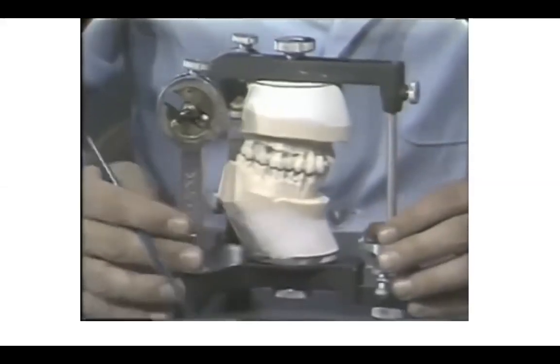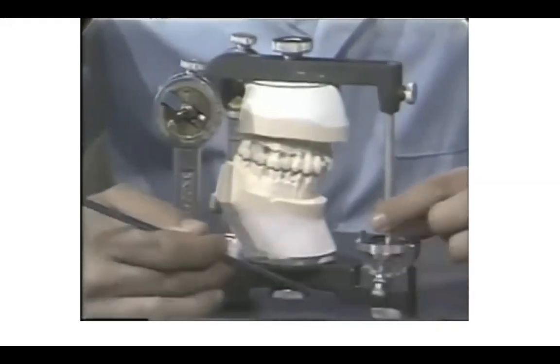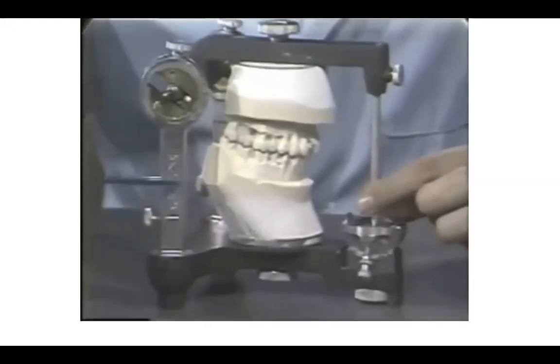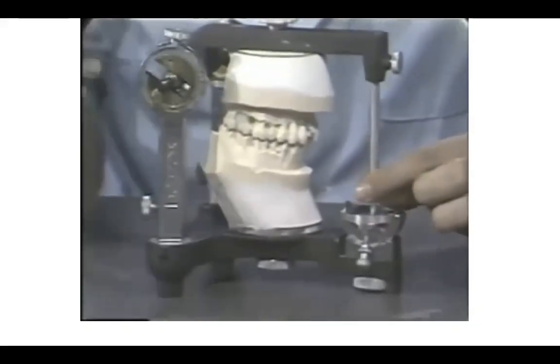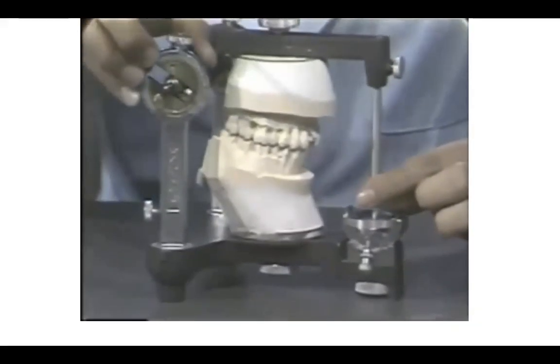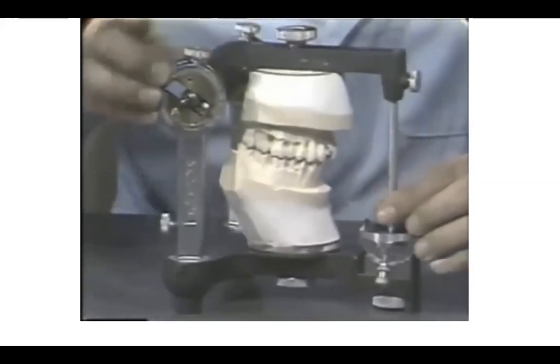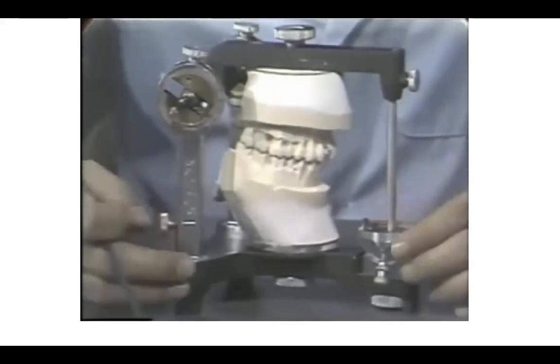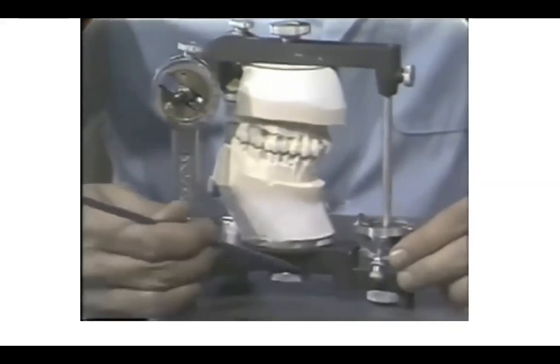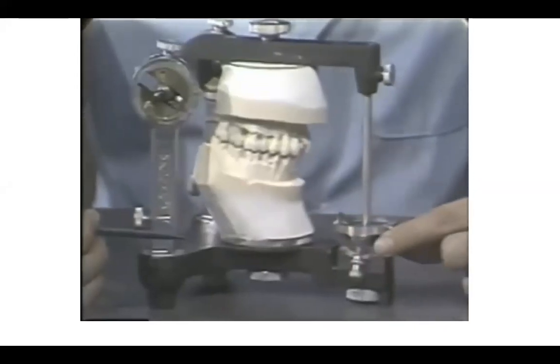Now, looking at the lower member of the articulator, we see it has a condylar element. It has a vertical axis and a lower member proper with an incisal guide table.